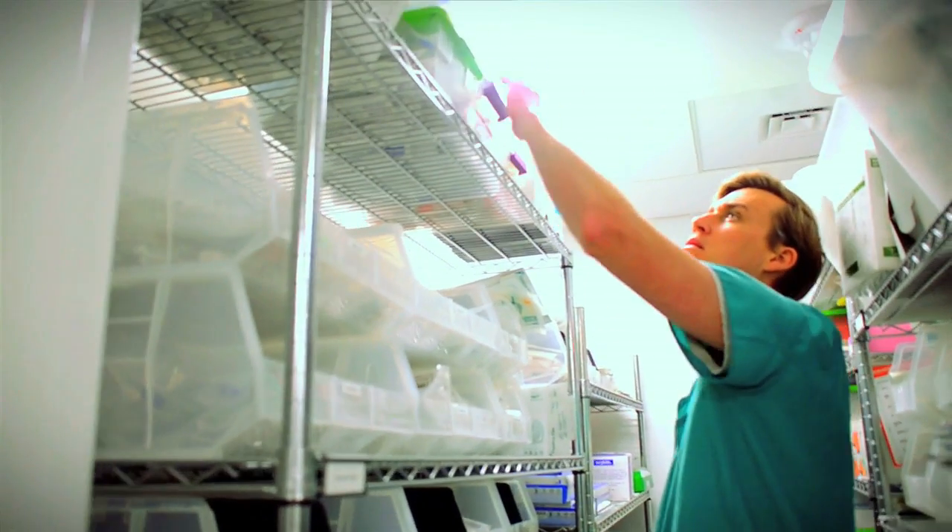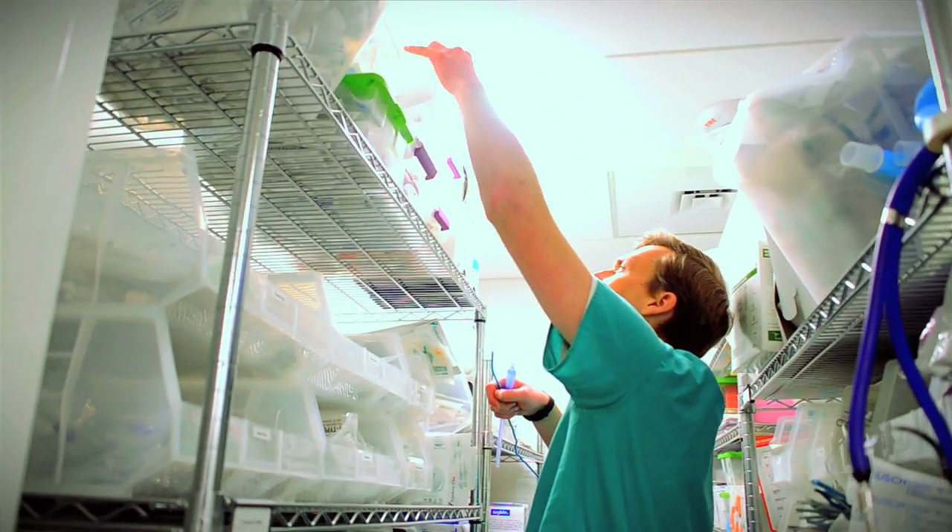That's the beauty of it — you can use things that you have. These aren't special order, they're not something you have to go out to Home Depot and buy. They're all routine hospital products that anyone should have in a simulation space.